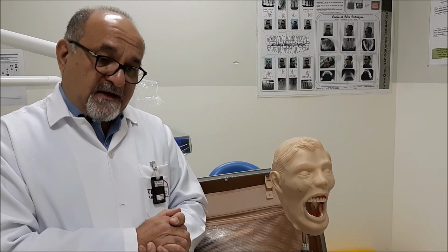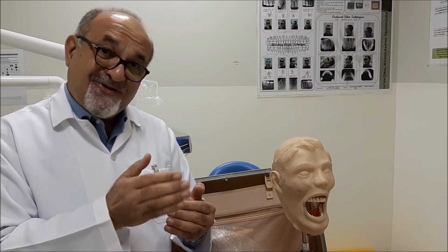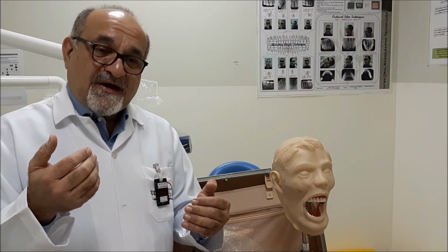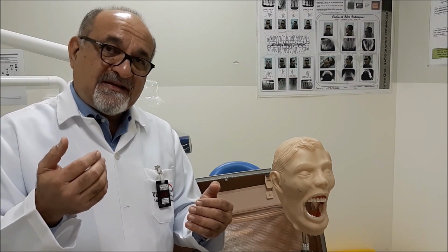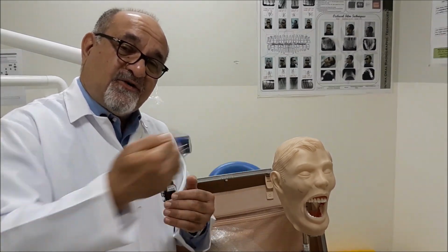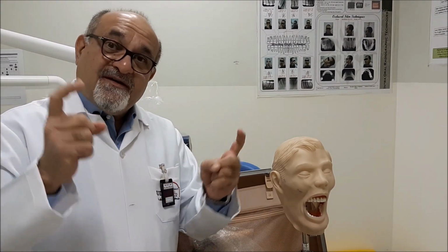So we will have a look in the tube shift technique. We will have a look from two sides. I always say that we can imagine that somebody is hiding, and you will try to have two looks, from right, from left, from up, from down, so that you can know where this person or thing is hiding.